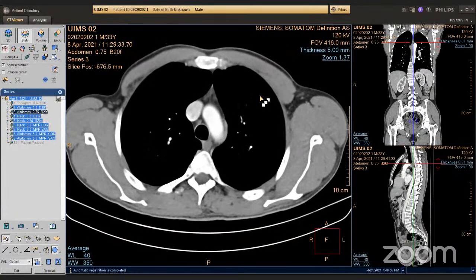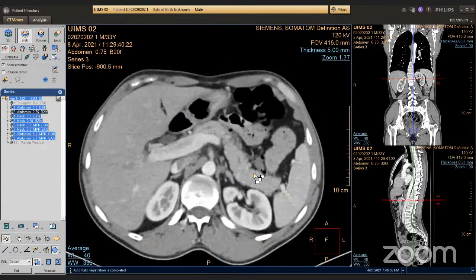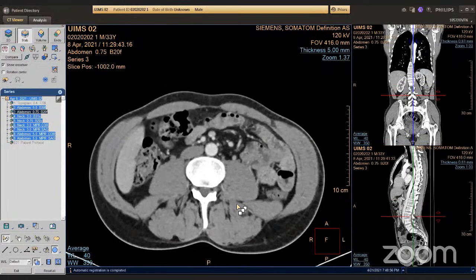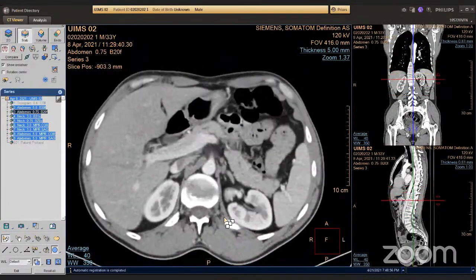It's the same thing as when I had a lecture on chest X-ray 2 weeks ago, where I told you to have a proper list of things to look for. The same is true for CTs. For example, with the abdomen, we usually start by checking liver, spleen, suprarenal glands, kidneys, pancreas, lymph nodes, intestines, and so on. It's not important in which order you do it. The important thing is not to forget anything. That's why we usually have pre-filled texts for describing that.